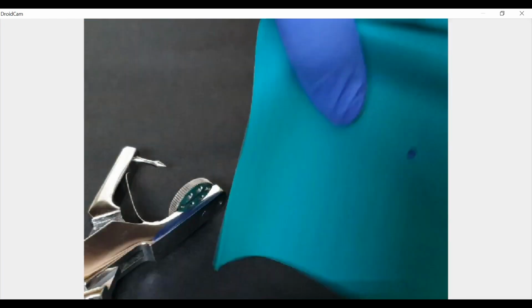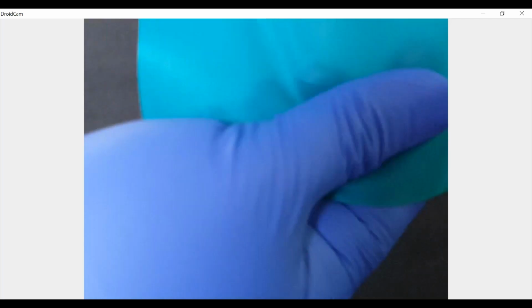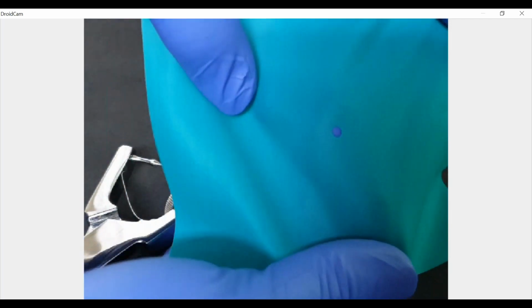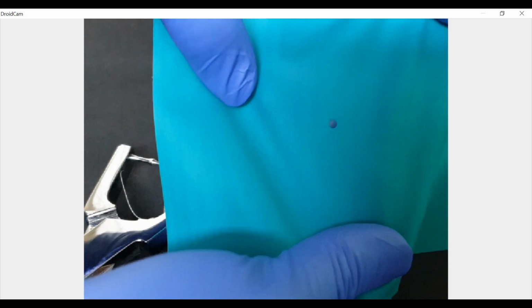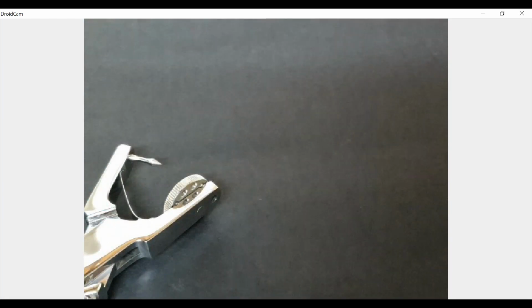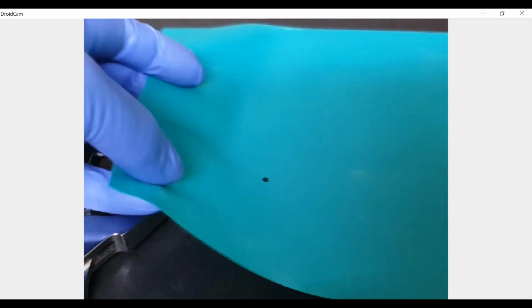Yeah, we're back. So observe the quality of punch. It's a neat and clean punch. If there is anything left behind, it will interfere with your isolation, and it can also cause the sheet to tear. And that again will compromise the quality of your isolation. Now that this is done, even if I just keep it aside, I will not lose orientation of my sheet.